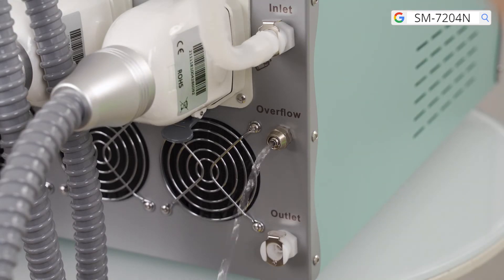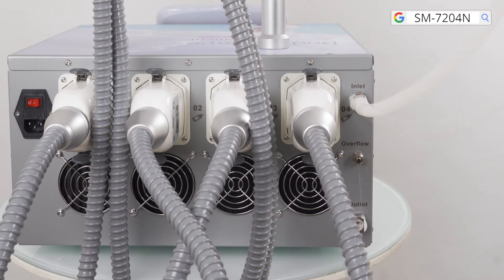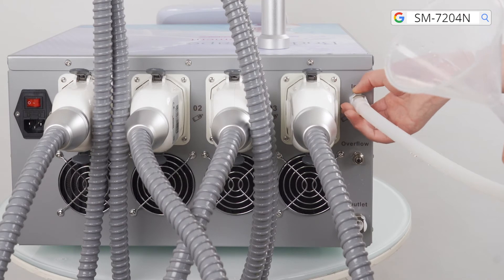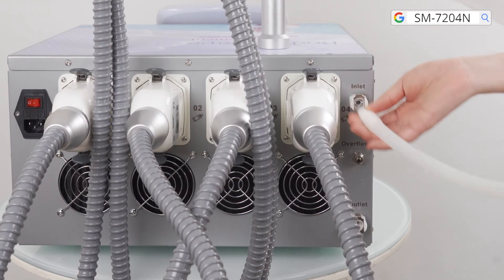When water comes out from the overflow hole, water inside the machine is enough. Disconnect the funnel from the machine by pressing and holding the fastener while pulling out the hose.